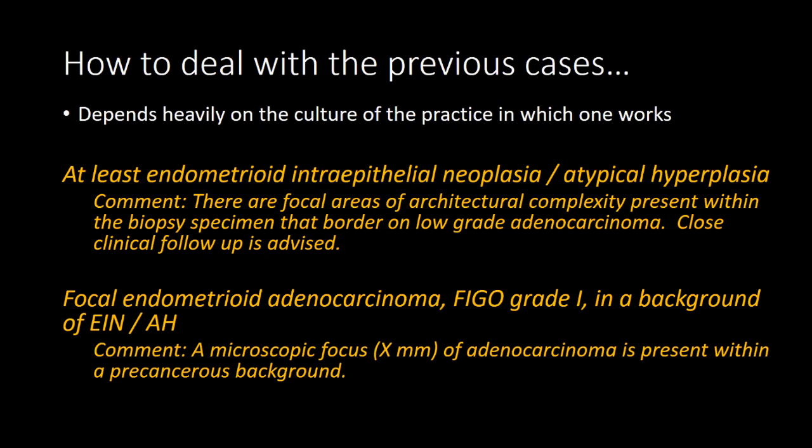But anyway, if I make that bottom diagnosis, one reason I mention that background is when I get the hysterectomy specimen, and I'm having a hard time finding adenocarcinoma, I go back and look at the biopsy and I said it was focal, so maybe I don't feel so bad. I still put in the entire endometrium to make sure there's nothing there. But a focal adenocarcinoma is a focal adenocarcinoma, and sometimes they are cured by biopsy. So that reminds my future self that I might not see adenocarcinoma in the hysterectomy specimen. So I like to add as much information as possible when I'm being descriptive like this.